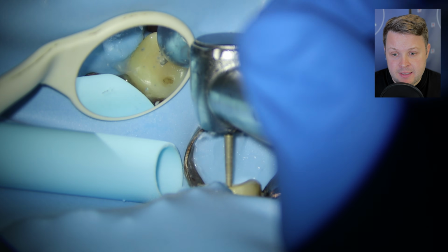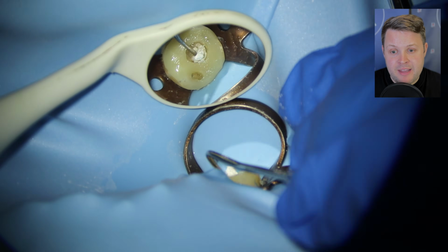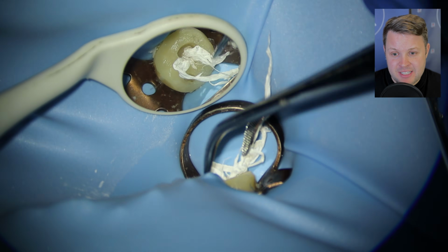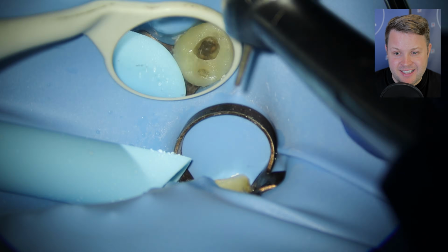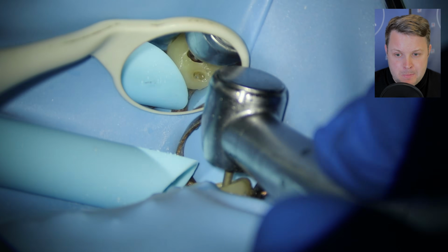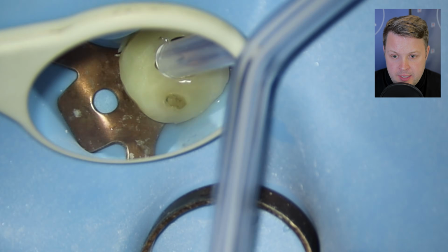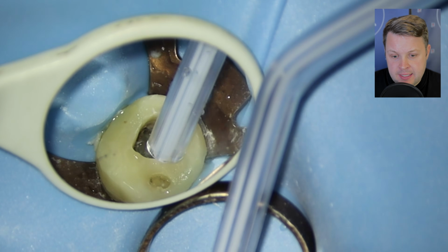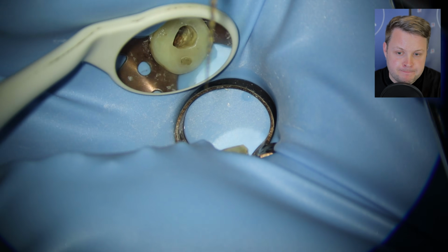PTFE dressing. Again, sometimes this can be really tough to remove if you haven't opened up the access cavity enough, and you pull this GP out like a string, so it can be a bit difficult. We've got access there, and we can see that we've got 3 canals that have been obturated. First of all, I'm going to go down the palatal canal.